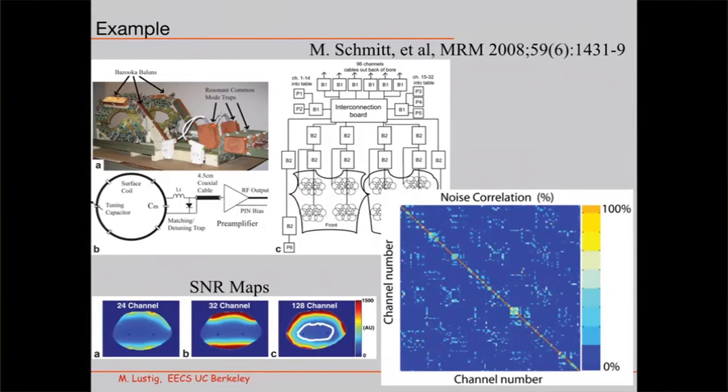You can see that there is some covariance element, but if the array is designed very well, then the energy in the off-diagonal elements is going to be low. So there's going to be weak correlation, and that means it's a good, well-designed array. If they're very correlated, that means these two coils see almost exactly the same thing, which could be a problem.